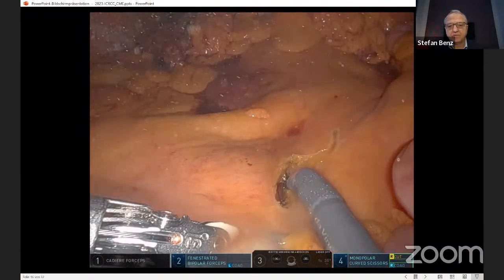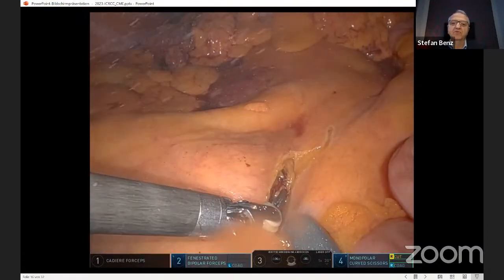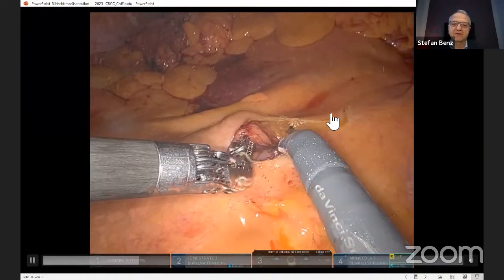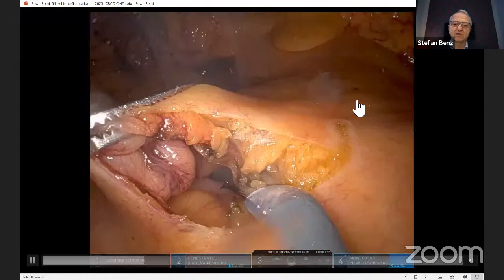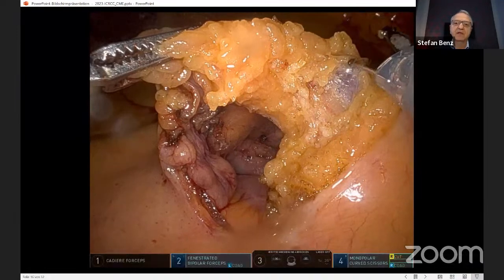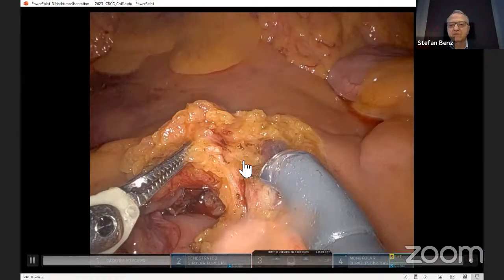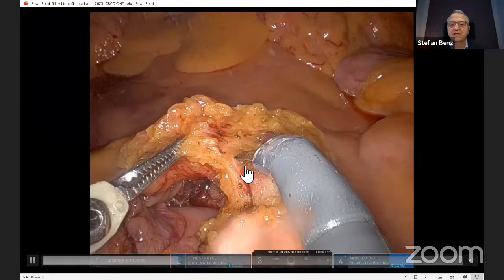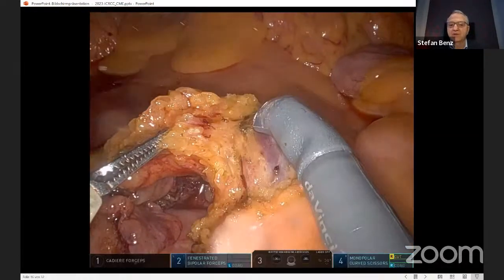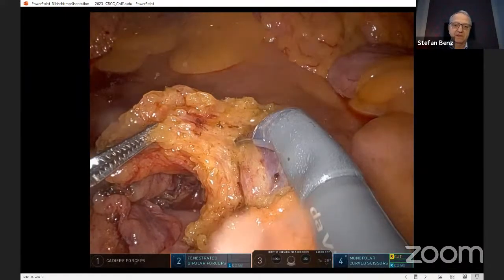And now we can move in there with an instrument and retract the meso. And then we can quite safely dissect our way onto the superior mesenteric vein, which is reached here. And here you already see the artery. If you have mobilized the mesenteric root in this way, you usually encounter the artery on the right side of the vein. So you're really already at the D3 level, if you want to put it this way.